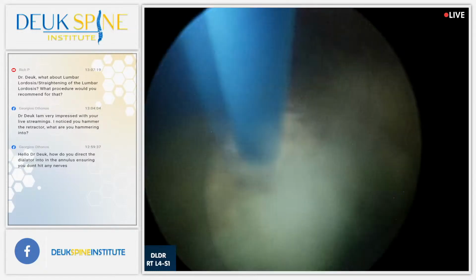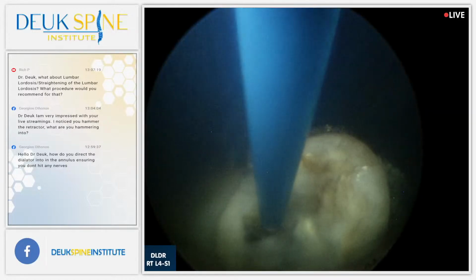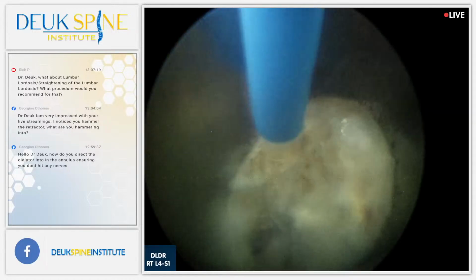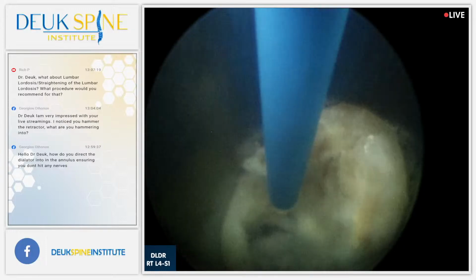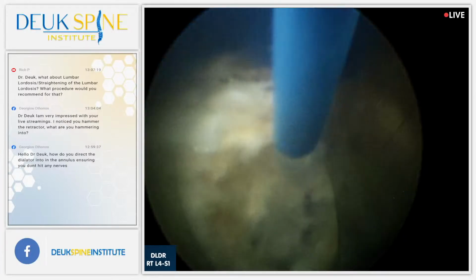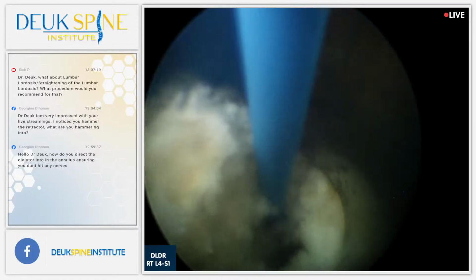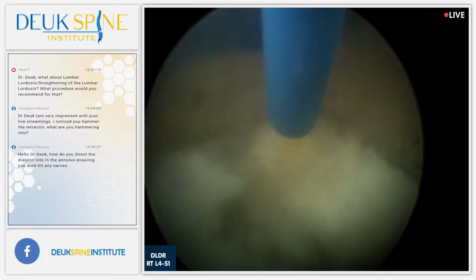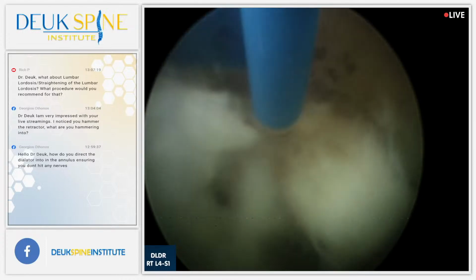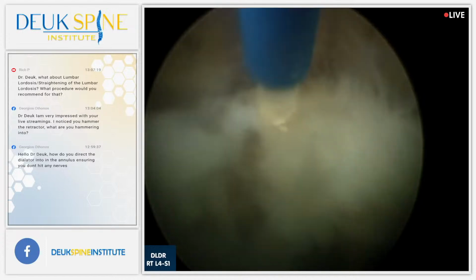So the best way to correct a flat back deformity, if you're going to do it, and I'm not recommending this because I don't think you need it, is to do first Smith-Peterson osteotomies. Remove the abnormal facet joints. You saw the facet joint on this patient. It's about 4 times bigger than normal. And that comes from a process called hypertrophy, and another name for it is arthropathy. Hypertrophy is enlargement.